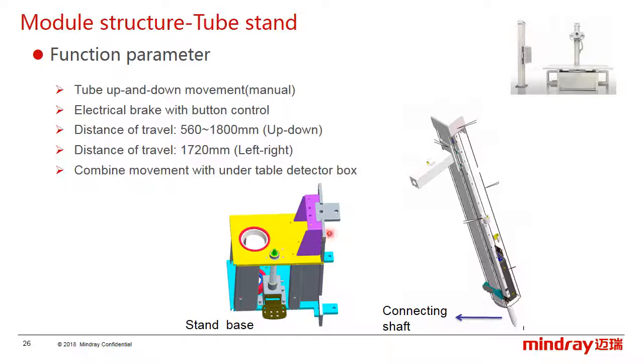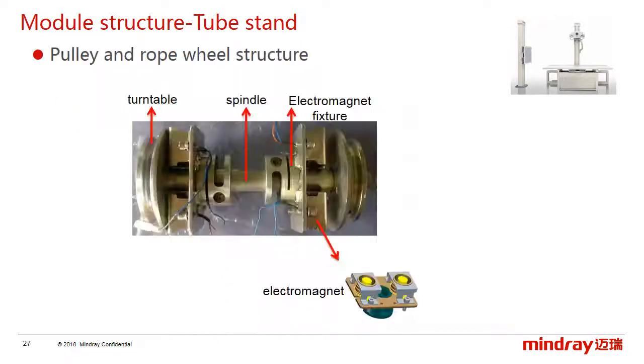Last, there is a connector assembly installed at the rear of the detector, which can connect to the tube stand.